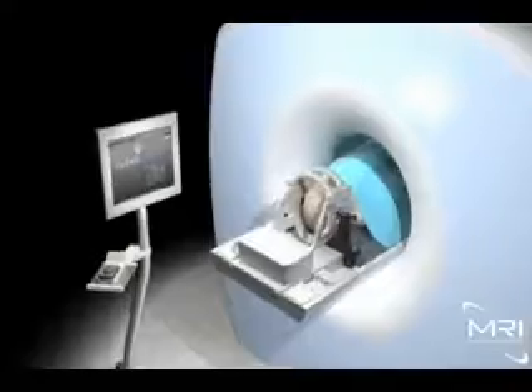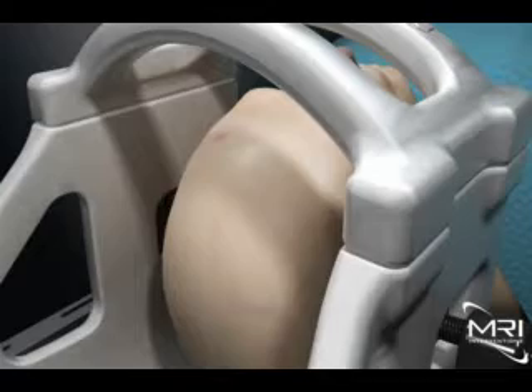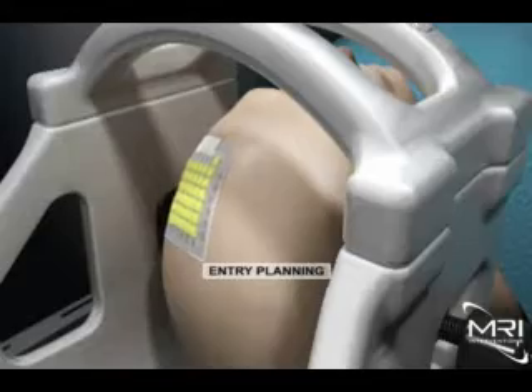The ClearPoint procedure is performed in a standard 1.5T MRI suite. The patient's head rests inside the MRI intervention's head coil and fixation frame. The smart grid is applied to the head and the patient is then advanced to isocenter to begin the procedure.